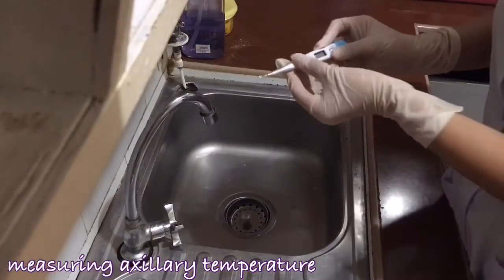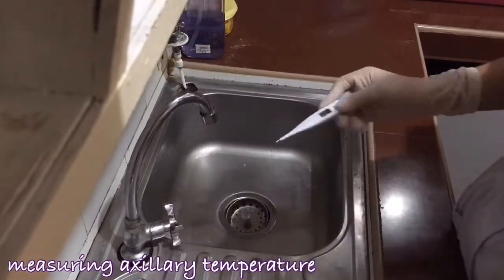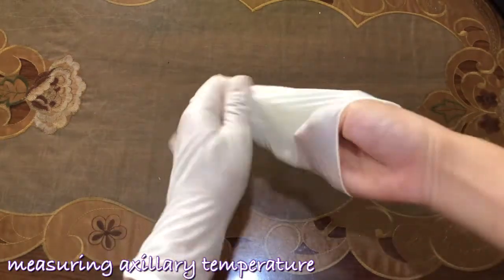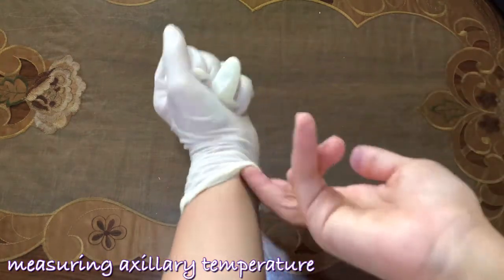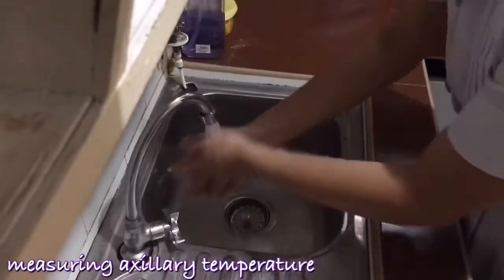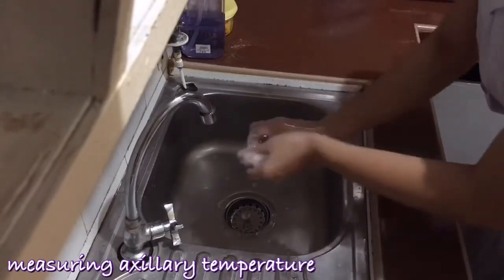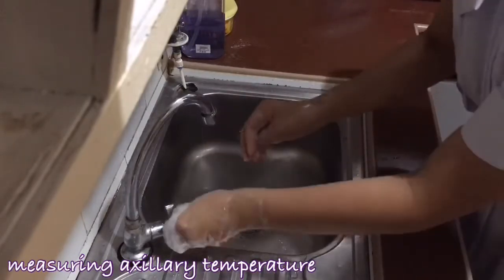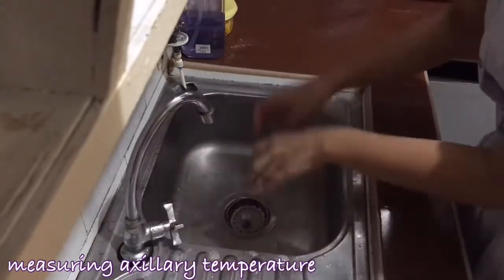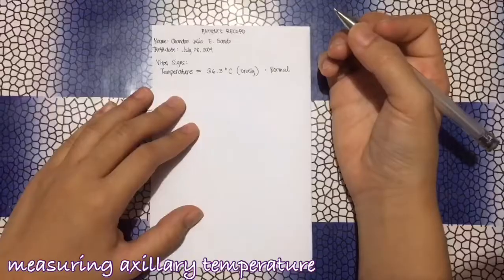I will now dispose of the probe cover and clean the thermometer. Then I will doff my gloves, wash my hands, and document the findings.